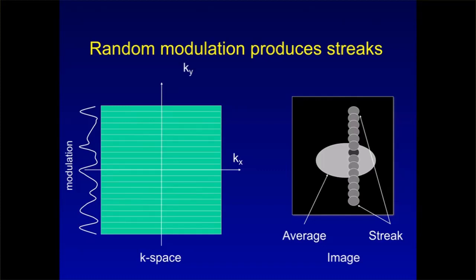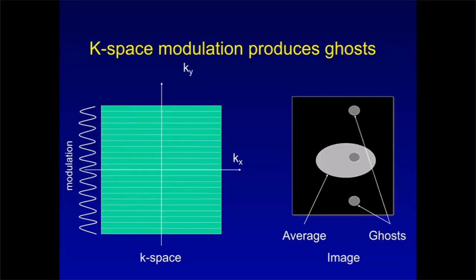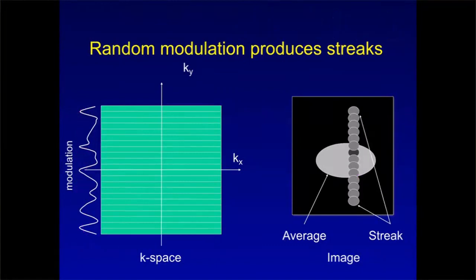And in fact, even in this case, if you just change the order randomly of K-space lines, then it's kind of like randomly shuffling the sinusoid and you'll get the same effect, right? It will also be spread out. So the fact that you're getting a very coherent ghost is because you're collecting lines sequentially. But if you would jump randomly between them, you would shuffle this randomly, and that would result in something that looks like this, and then the artifact would look like that. Okay.